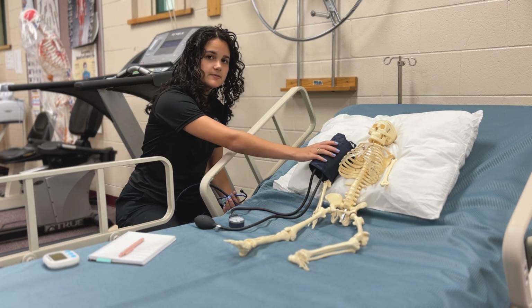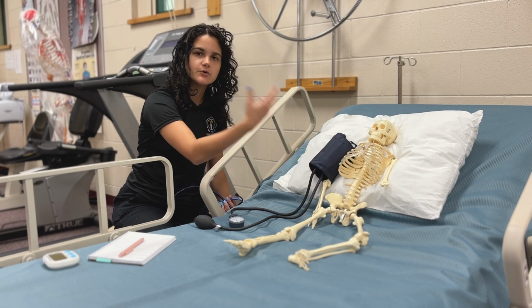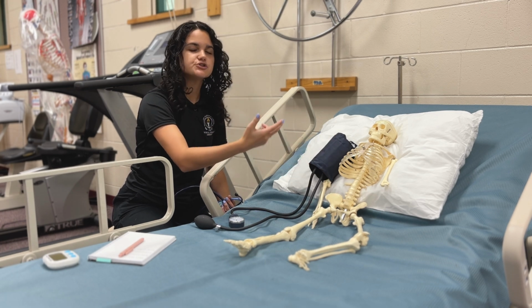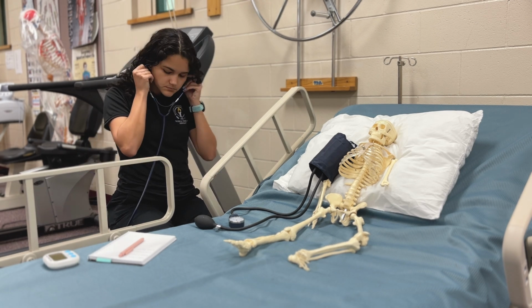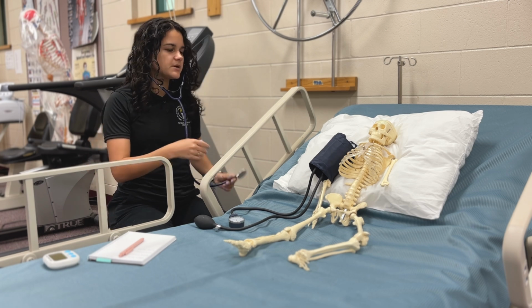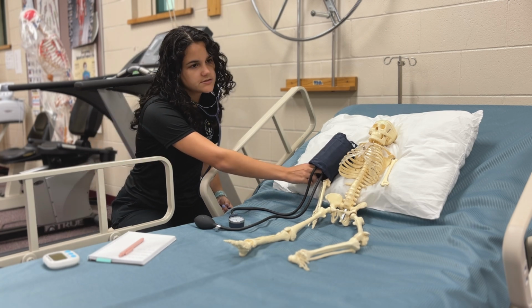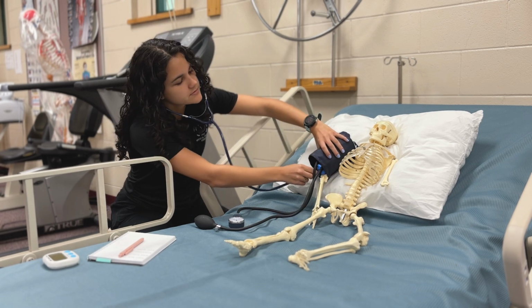I've put the cuff on his brachial area because I'm going to be using his brachial artery to hear that pressure against the vessel walls. First, I'll palpate to feel the artery. Once I found it, I'll place my stethoscope right on it.